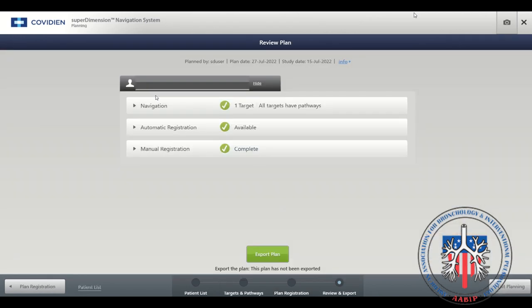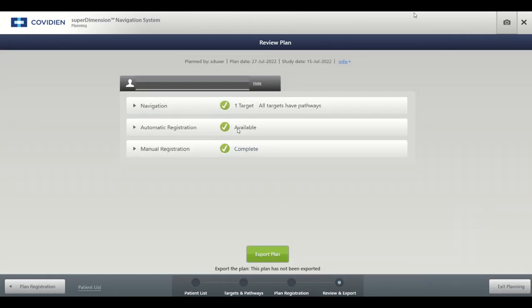The plan is then reviewed. Navigation is planned, automatic registration is available, and manual registration is complete. Select Export Plan to transfer the plan to a USB drive.